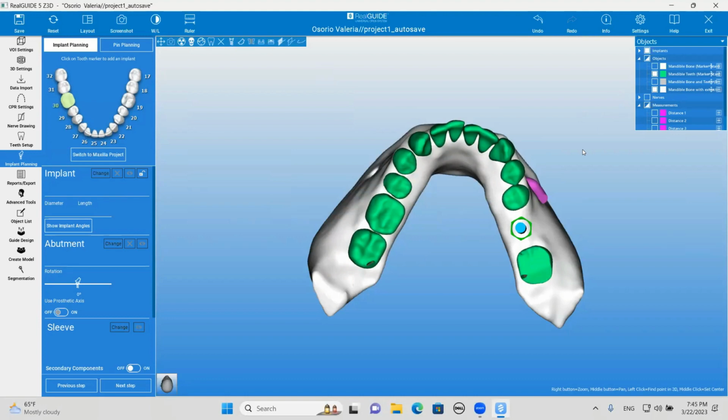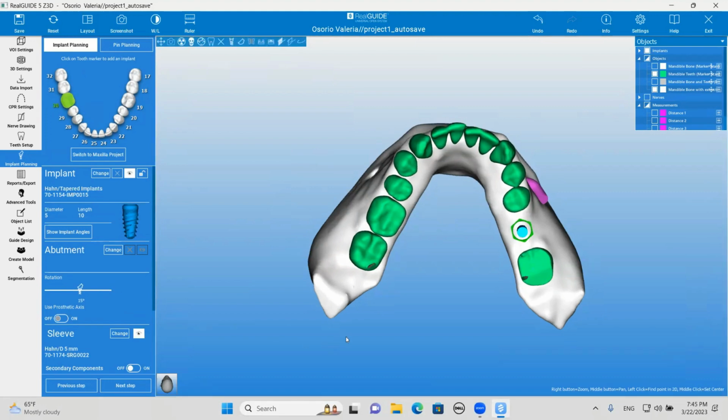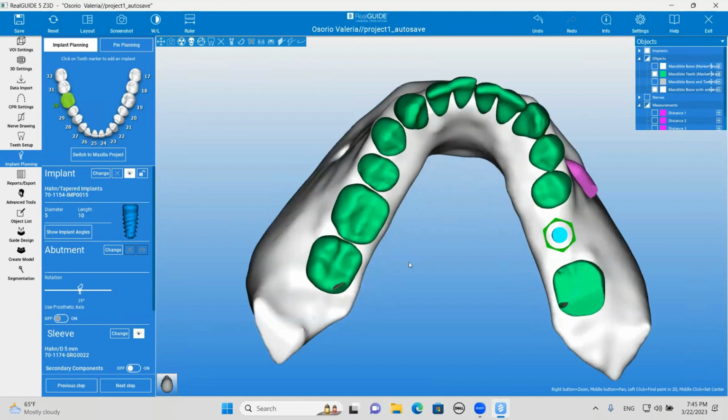You know what I like to do on those, Jimmy, is use like a 169. That would be like a tapered crosscut Fisher bur, or you can even get like a half round bur and make small little decortication holes. You don't want to use like a 171 or anything like that because the holes would be too large. So you want smaller holes.